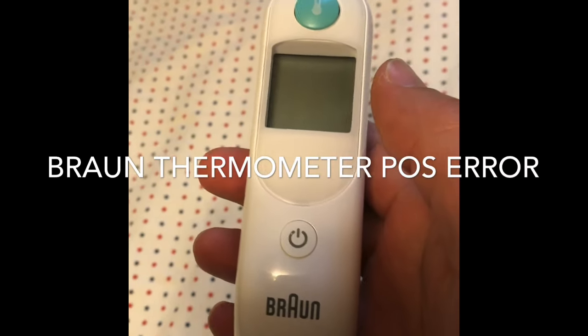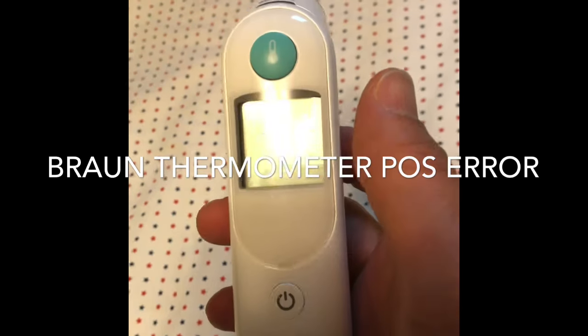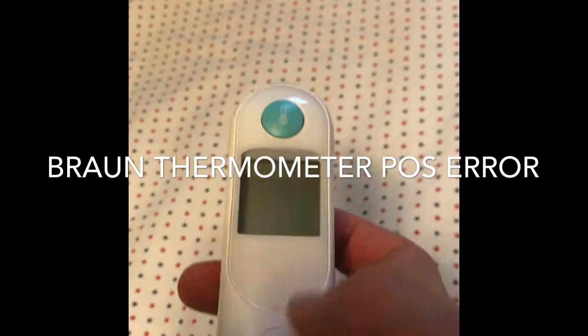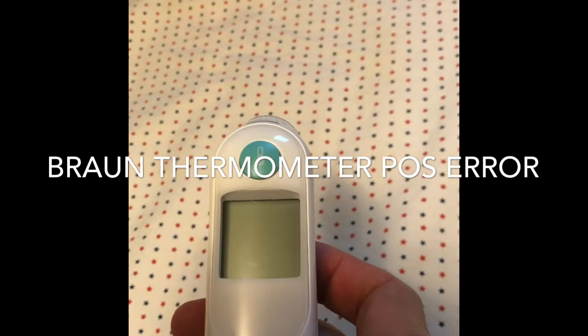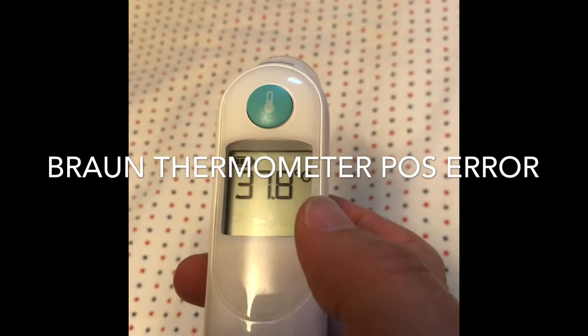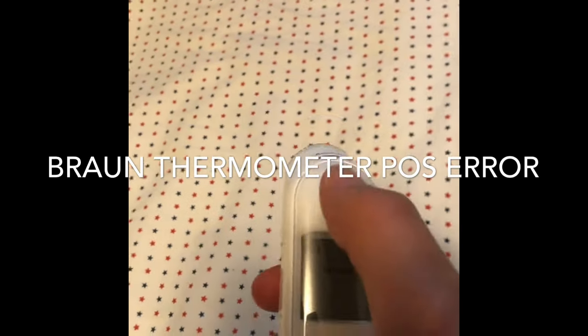I got a Braun thermometer, a ThermoScan series. However, it has some problem. Now when I turn it on — alright, seems everything's okay. Now I test my temperature.